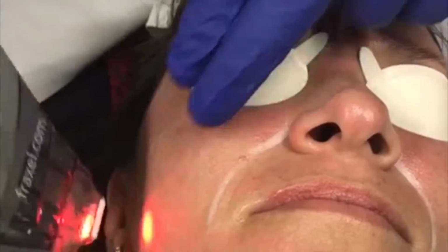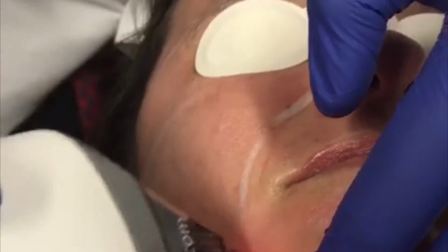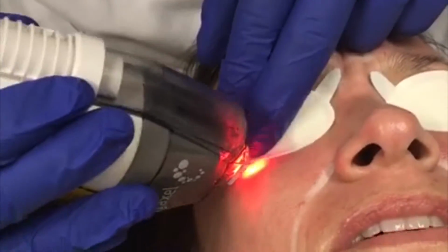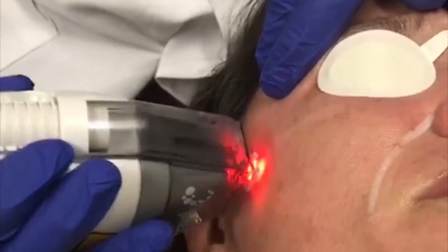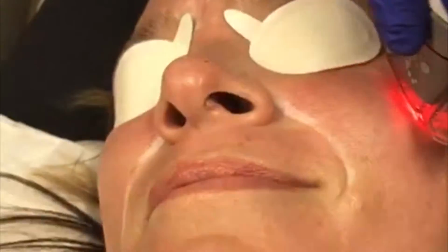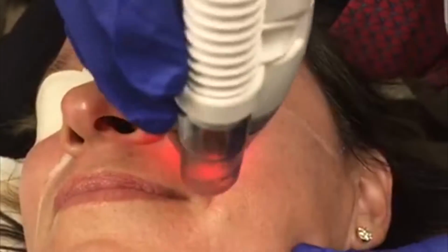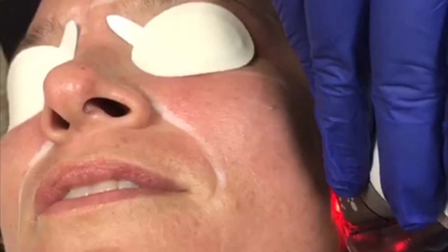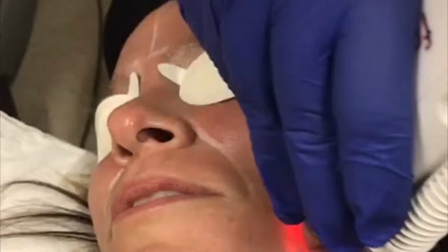I think it's very important to understand how fractional laser resurfacing can be positioned in your practice. In my mind, this procedure, as far as downtime and also the results, is somewhere between a procedure like microneedling with platelet-rich plasma and something like fractionated CO2 resurfacing. So patients will have more downtime than they will with microneedling with PRP, but they'll have less downtime than they would with fractionated CO2 laser. And I think explaining that to the patients is very important so they have realistic expectations of their results and also of what their downtime would be.